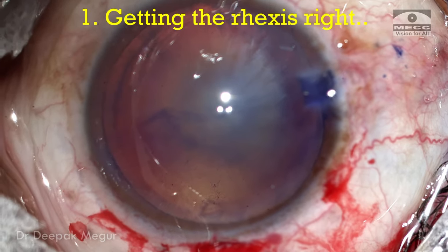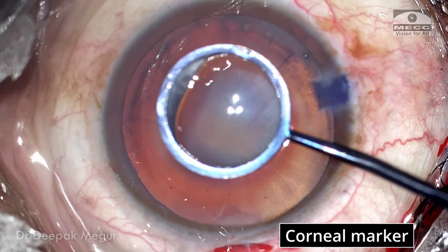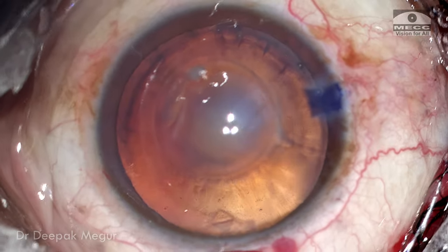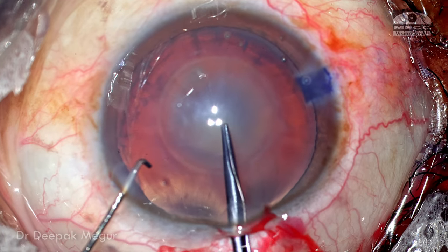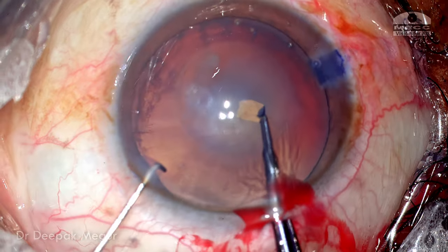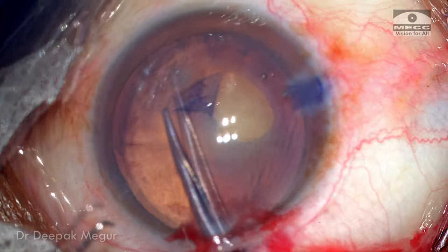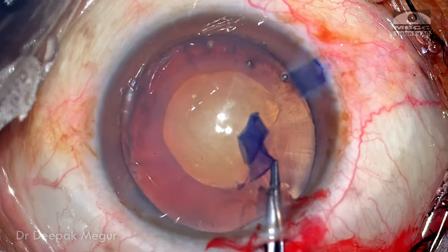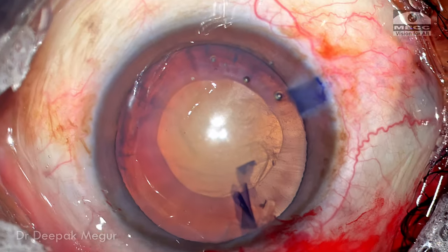The major step in this surgery is the rhexis — getting a well-centered and appropriately sized rhexis is extremely critical. I'm going to use a corneal marker to guide me in achieving a 5 mm rhexis. Although the very deep chamber creates a parallax effect that may reduce accuracy, it still gives a rough guide rather than relying on the extremely well-dilated pupillary margin. I see a few radial folds in the capsule as it is punctured. The flap is raised and capsular tearing begun, staying on the template. The capsule tears well and I don't find any zonular laxity. I've got an appropriately sized rhexis, though maybe a wee bit eccentric.